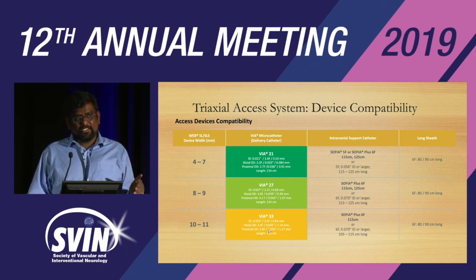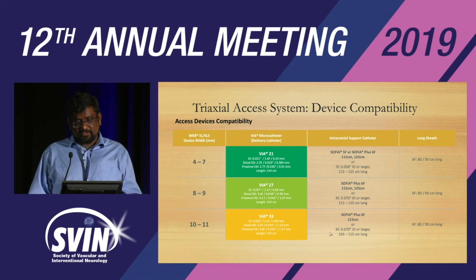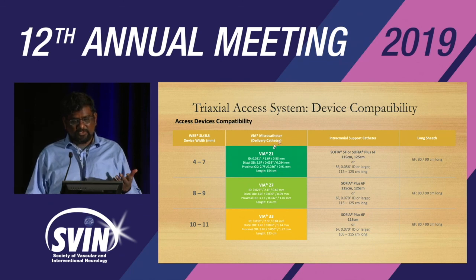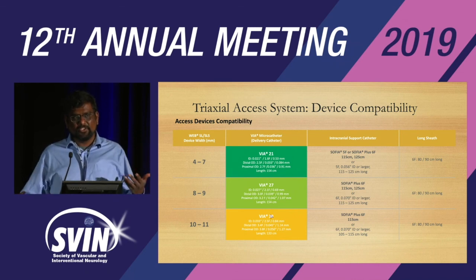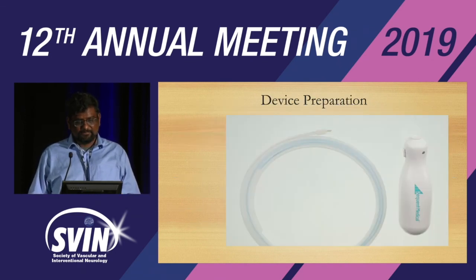You actually track it over a 017 catheter. You can use Headway 17, XL 17, whatever you like. And obviously the 21 goes through the 5, the others go through the 6. Now, if you feel like you need a balloon in addition, the balloons are not generally going to fit in next to the VIA catheters, so then you have to have a larger sheath. So you get 8 French access, or you do bilateral groin punctures, or if you're going radial, you can do 1 radial, 1 groin, something like that.